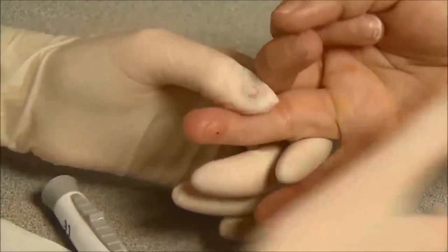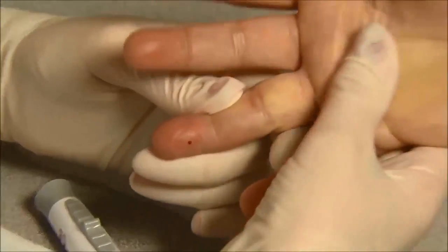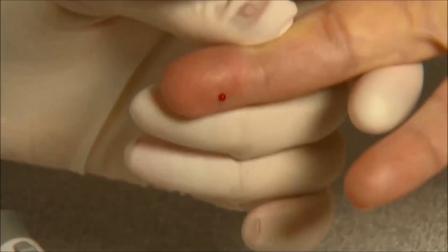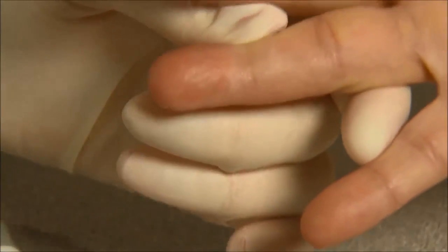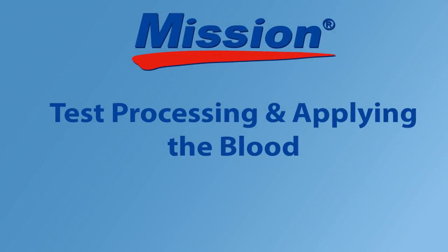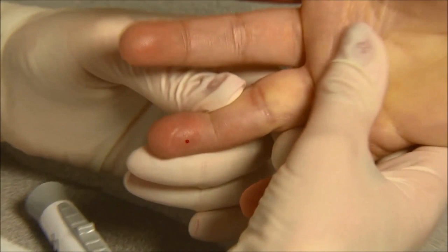Gently massage from the base of the finger to the tip of the finger to obtain the required blood volume. Do not excessively squeeze the finger. Wipe away the first drop of blood. Apply light pressure to obtain a second drop of blood. Do not apply specimen sample directly on the test device.